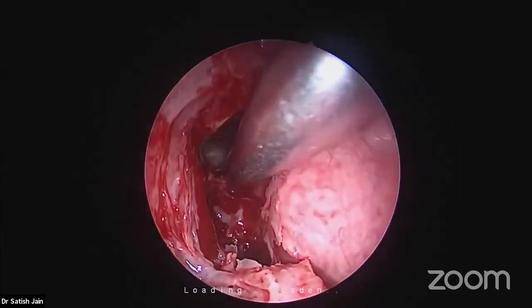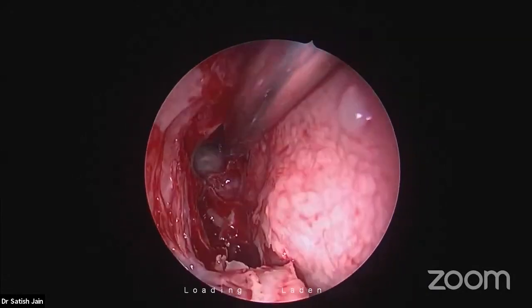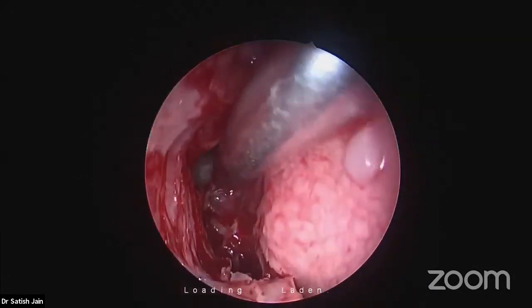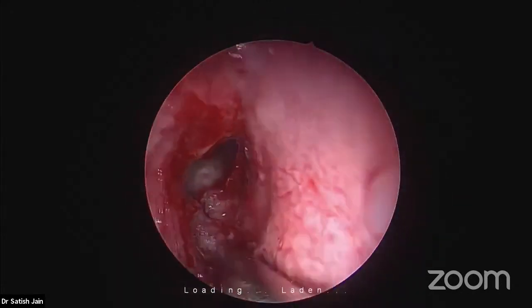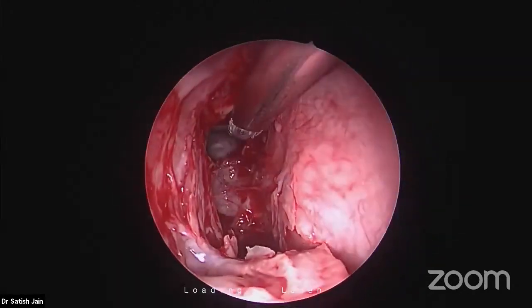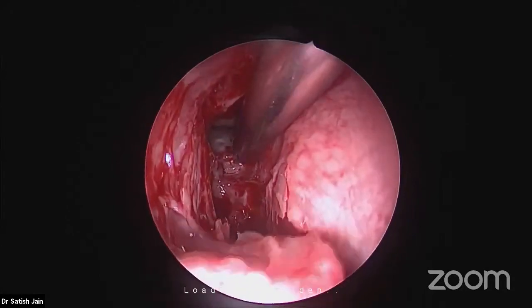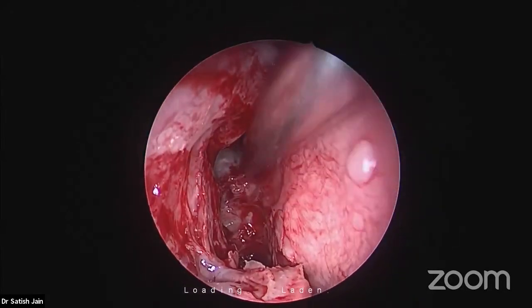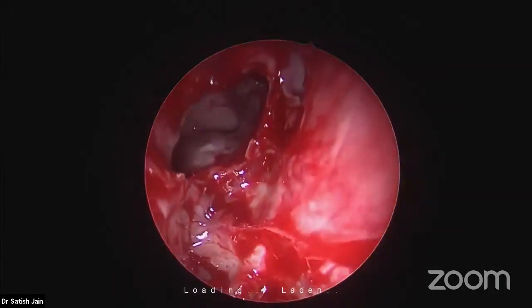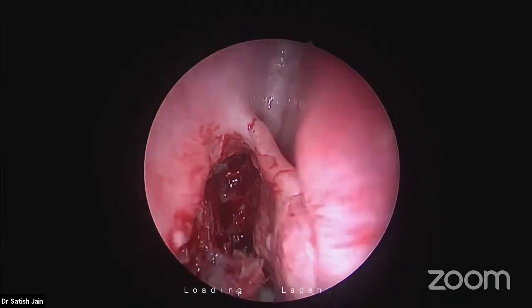And see, this has other names also. See the suprabullar recess? Can you see it very clearly? This is also known as fovea. Fovea literally means impression. This is the ethmoidal cell, and this roof where I am touching, this cell's roof, is formed by the frontal bone. So it creates an impression on the frontal bone, that's why it is known as fovea ethmoidalis as well.